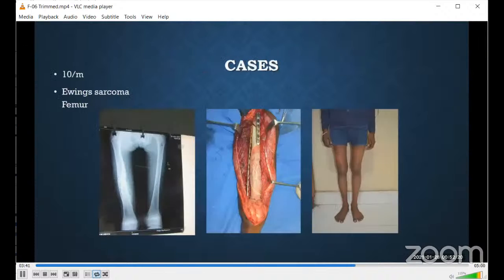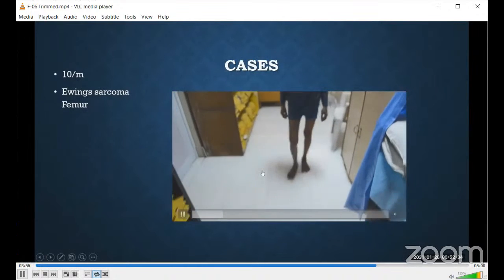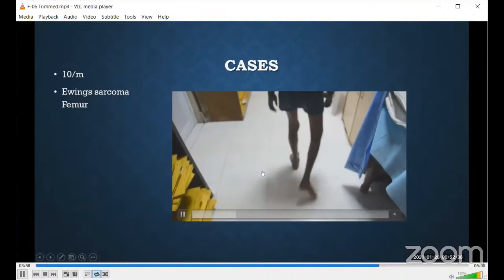This is a case of a 10-year-old male with Ewing sarcoma of the femur. Here we can see the chevron osteotomy at the diaphyseal site with an additional plate. And at 2 years of follow-up, the patient had a good functional outcome. He was able to walk without support. He had a good range of motion of the knee joint.